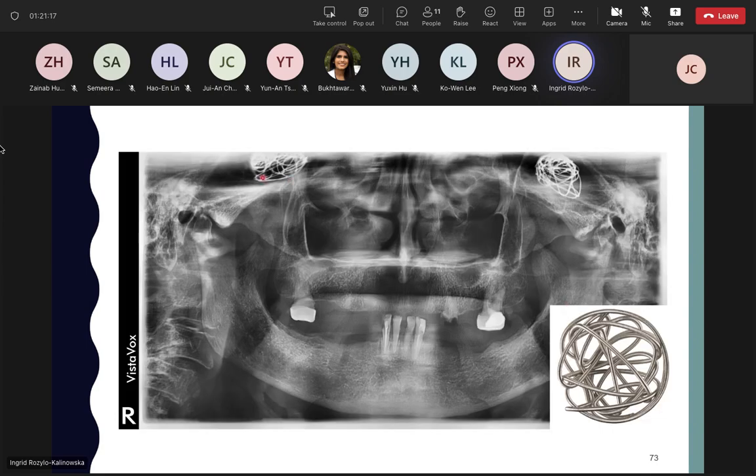And maybe you remember from the second year the catheterization, so placing catheters into blood vessels and using these catheters to administer contrast medium to demonstrate the blood vessels in the lesions in the body, but also the catheters are used for treatments if there is an aneurysm, like cerebral aneurysm.